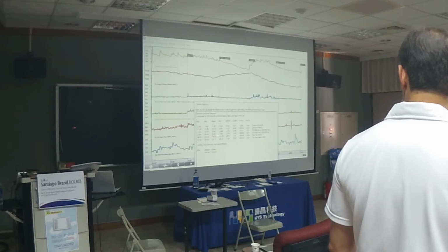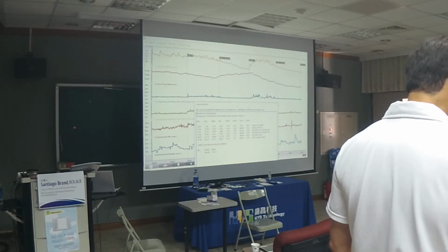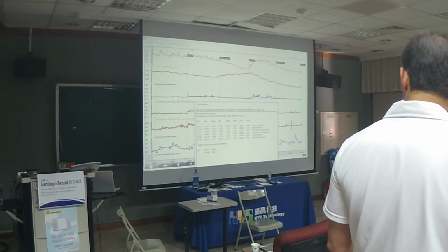We have a 76 for heart rate, went up again. So that's significant. It's not something to get too scared about, but it's significant. The muscles 6 and 5 here. The temperature went down again, and the GSR went up again.